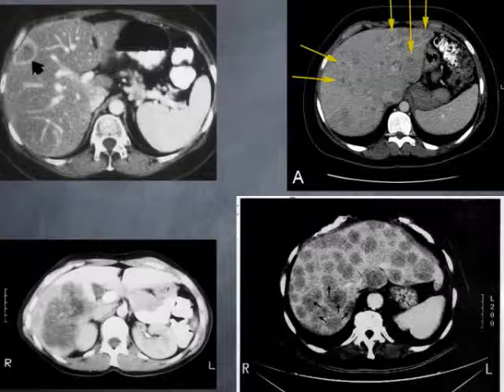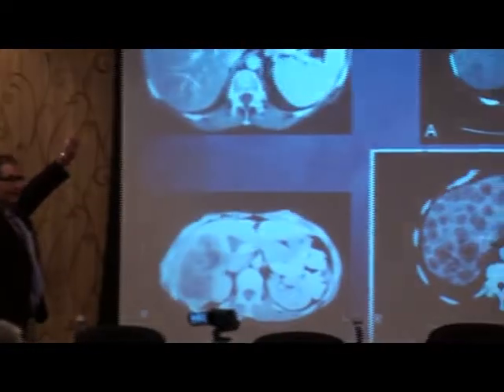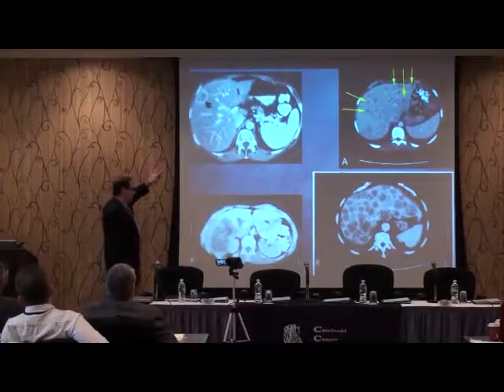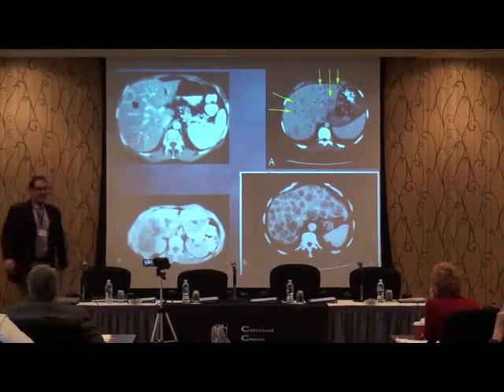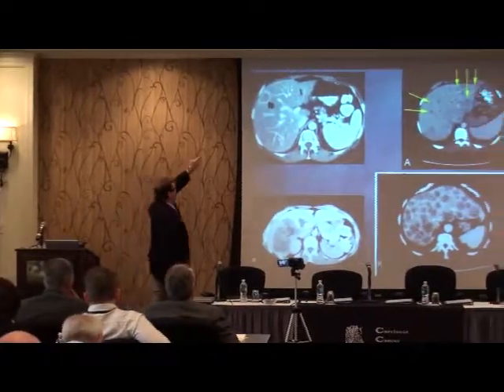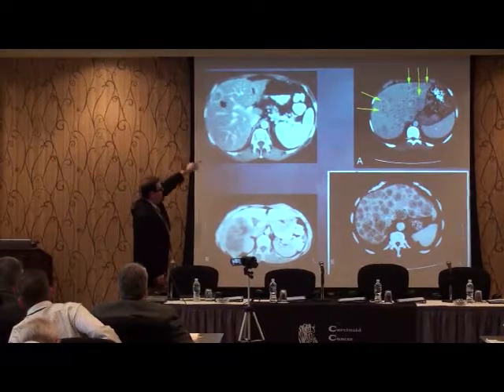So here's multiple imaging studies that we can look at. This is a CAT scan. Again, not the best tool at looking at metastases, but certainly we pick them up every day like that. On the top image, you can see how subtle it is, but there's at the periphery, at the edge of that image, a liver metastasis surrounded. It's the gray on the inside and a little white on the outside.